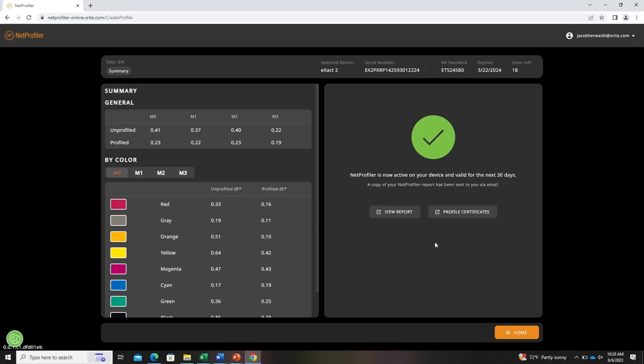Now you're done. You've created a profile for your device. If successful, you'll see a green check mark on this page. If there was any failure in the profiling process, there will be a red X on this page with the reasons of failure indicated below.